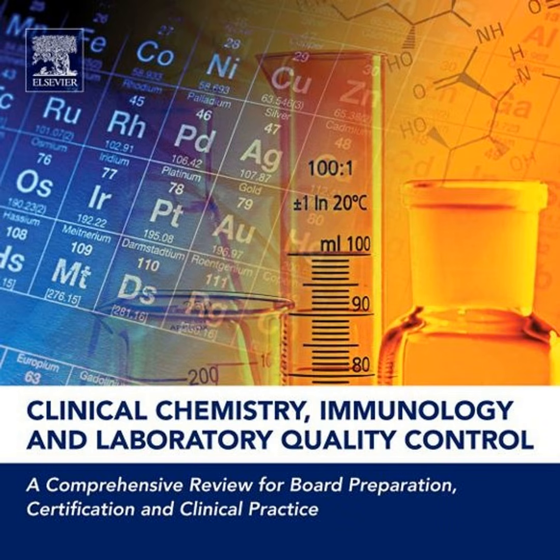Icteric samples, yes. And hemoglobin released by hemolysis, which makes samples red. These substances absorb light right where many common assays are run, causing interference, although typically they only cause major problems when the concentrations are really high, for bilirubin usually above 20 mg/dL. And then there are the pesky heterophilic antibodies.